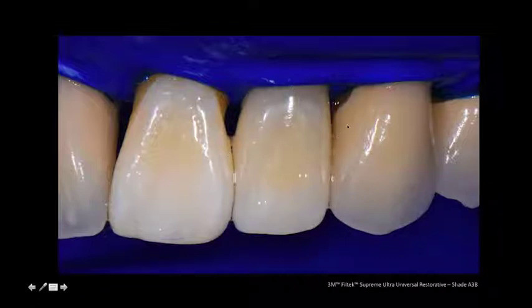Now, because I was treating those black triangle areas, I didn't close it fully because I was trying to maintain some nice tooth form and symmetry. But if I'm going to basically mask a black background, I need to have some opacity. So I think one of the mistakes that a lot of people make when they do these restorations, because they're wanting to have a good transition for color, is that a lot of times people choose a shade that's too translucent, and so they don't get effective block out of color where they actually want it.